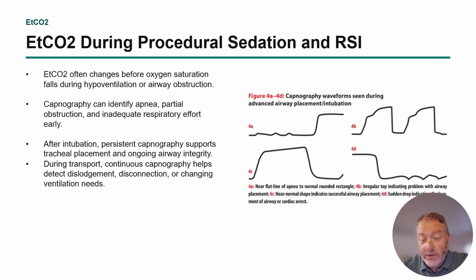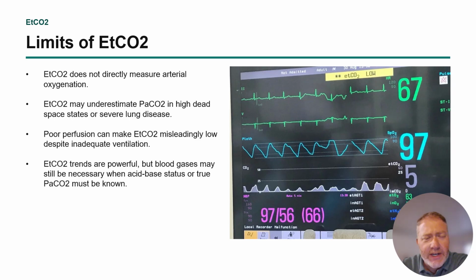After intubation, persistent capnography supports tracheal placement and ongoing airway integrity. And then during transport, continuous capnography helps detect dislodgement, disconnection, changing ventilation needs, all sorts of monitoring parameters. There are several limitations to using end tidal CO2 monitoring.